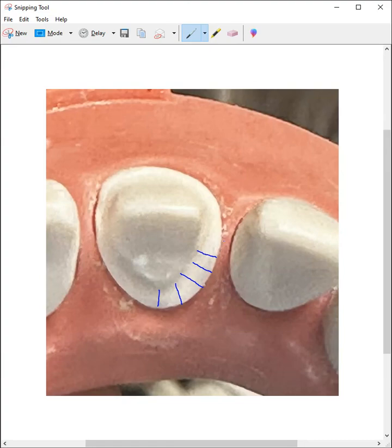So watch this — use a small thin diamond and just be really slow, saw through really, really slowly. It's just patience. If you need to take a break, take a break. This prep and the bridge prep, it's a long day. So just give yourself a break, take your time so you can get through these contacts.